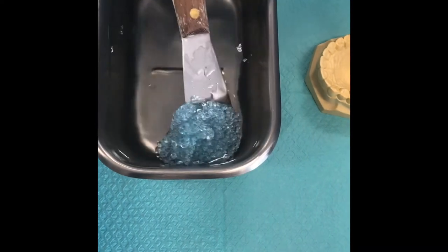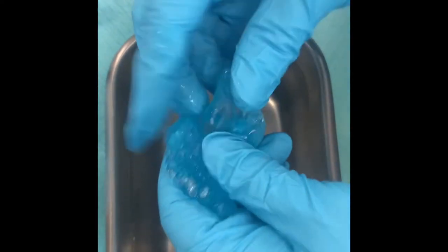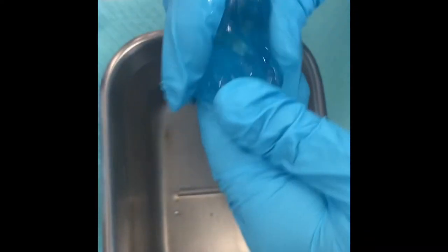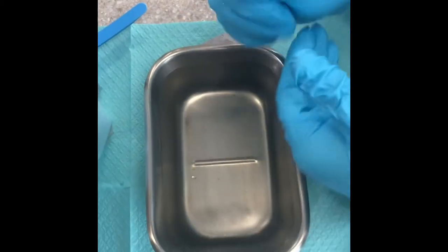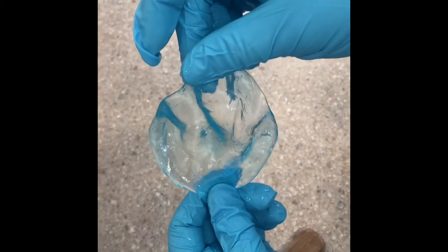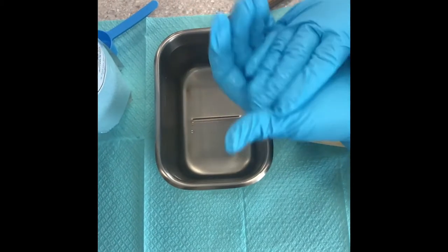After about 15 to 20 seconds, take a spatula and squish the pellets together. They form almost like a putty material. You know it's heated enough when all the blue has turned clear. At that point, roll it into a ball.